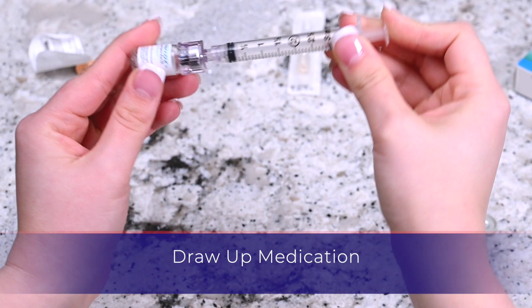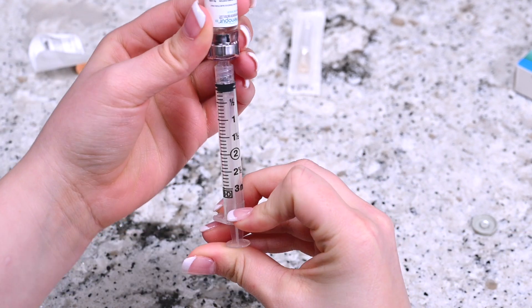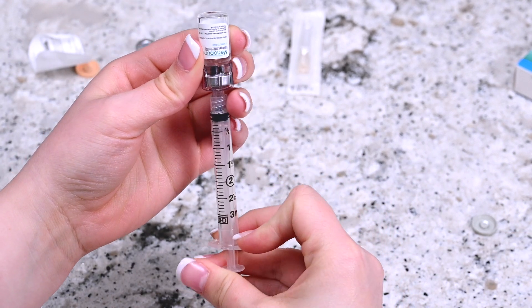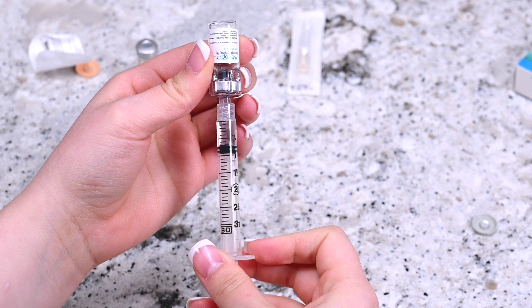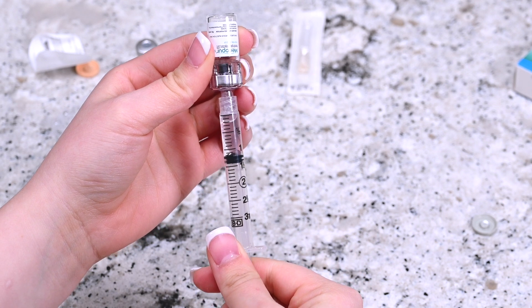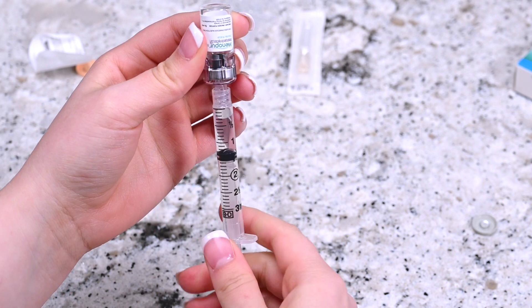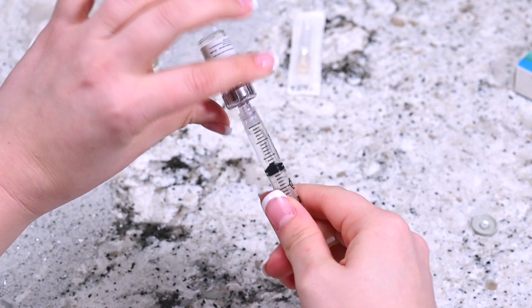Invert the syringe without removing it from the vial and pull the plunger back until all the contents from the vial transfer to the syringe. Once finished, remove the syringe from q-cap and the vial and set it aside.